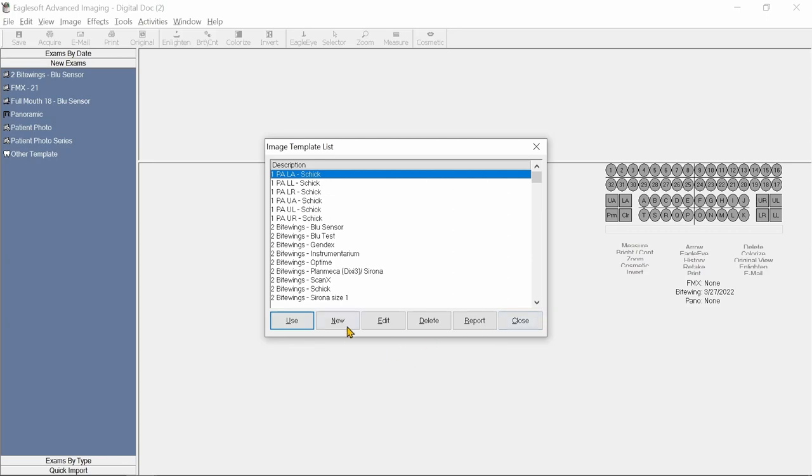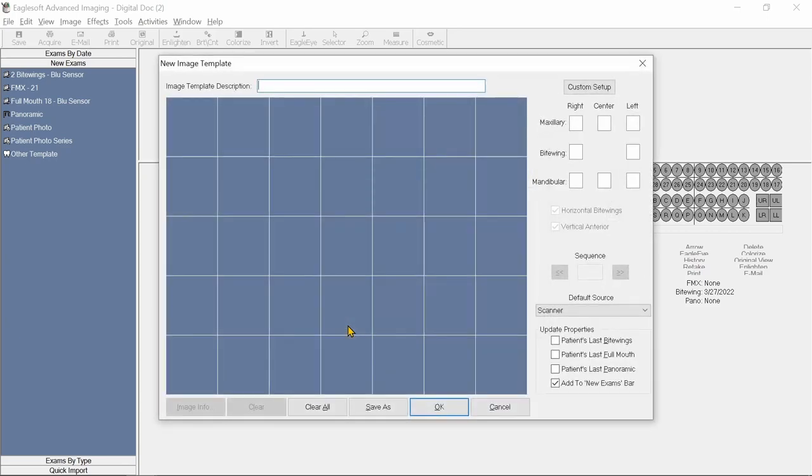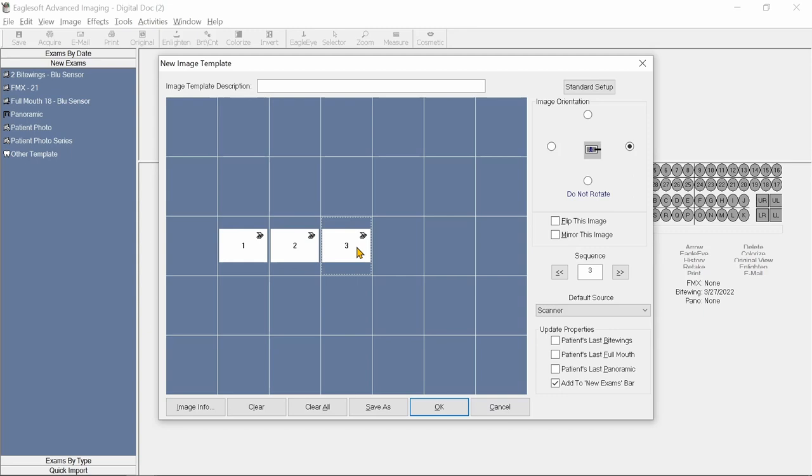We'll click on New. You can also base a new mount on a previous existing template. In the New Template window, we'll click on Custom Setup, and then we'll select the images we would like to acquire and in which sequence we would like to acquire them.